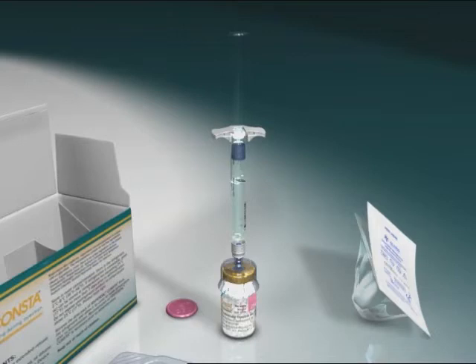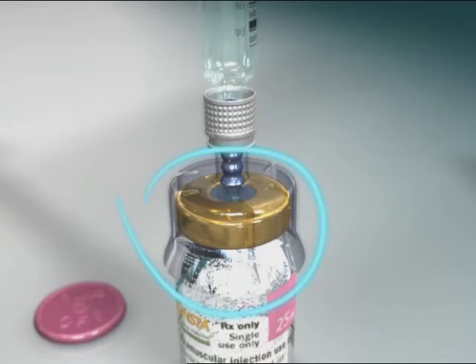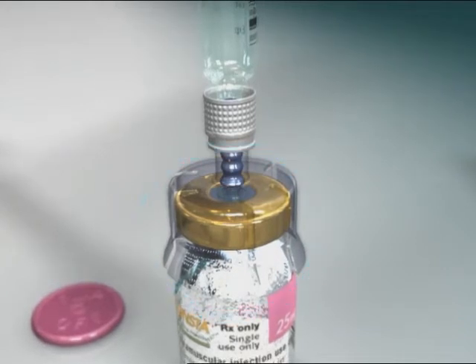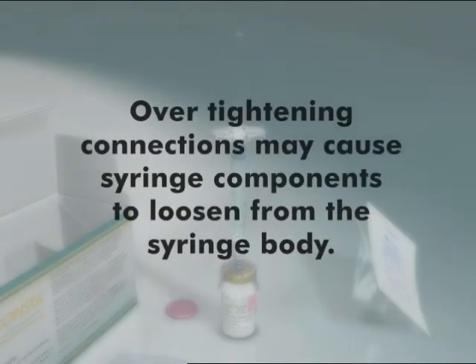Then twist in a clockwise motion to secure the connection of the syringe to the SmartSight access device. Avoid over-twisting. Hold the skirt of the SmartSight access device during attachment to prevent it from spinning. Be sure to keep the syringe and SmartSight access device aligned, and be careful not to over-tighten components when assembling.